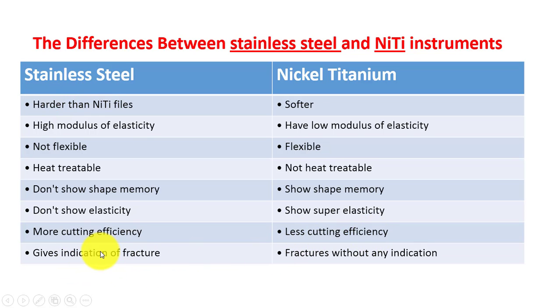Stainless steel, before a fracture, gives a sign, an indication of fracture. But nickel titanium gives no sign, no fatigue, nothing, it just fractures. That's why I always tell doctors and dentists to be more careful when they're using nickel titanium.